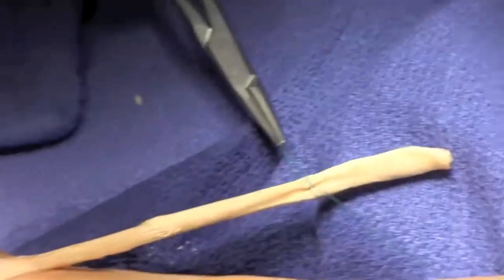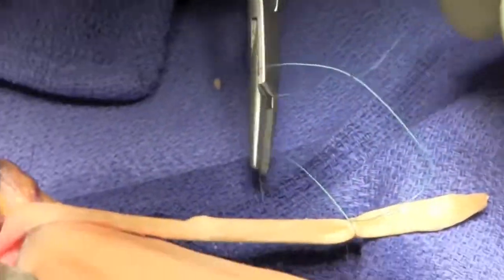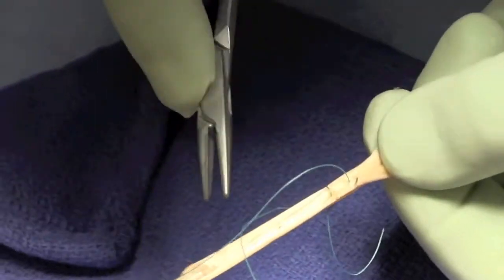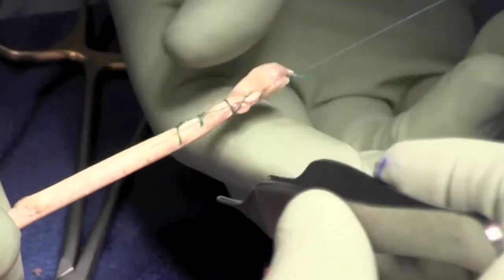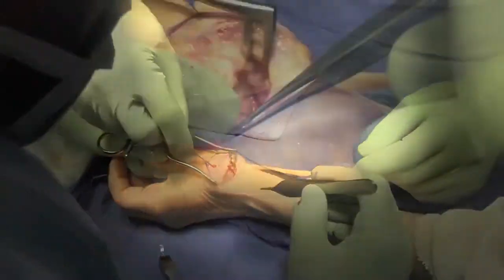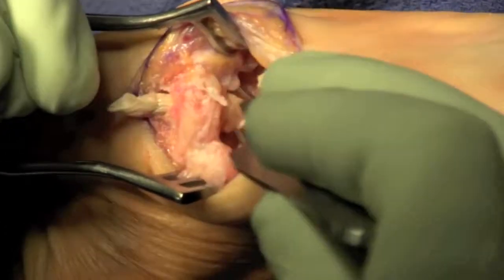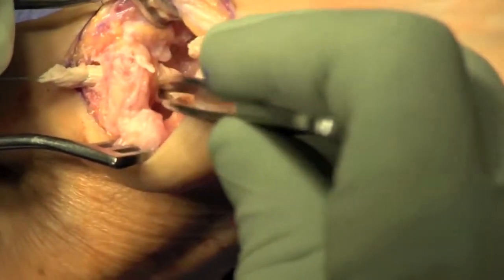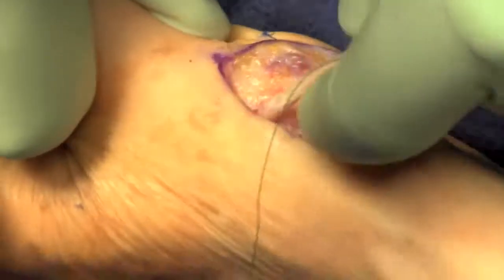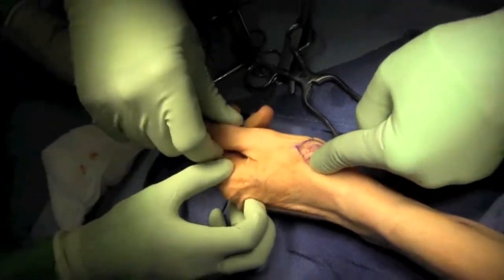The proximal end is sewn together in a tapered fashion to help prevent fraying of the tendon as it's passed through the bony tunnel. A 24-gauge wire is then used to pass through the bony tunnel, capture the suture of the proximal flexor carpi radialis, and the tendon is passed through this tunnel, mimicking the ligament reconstruction.